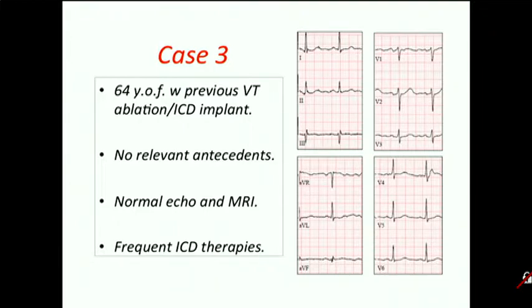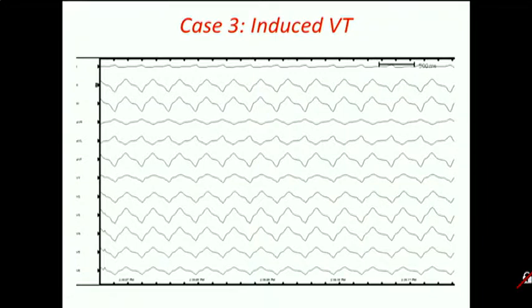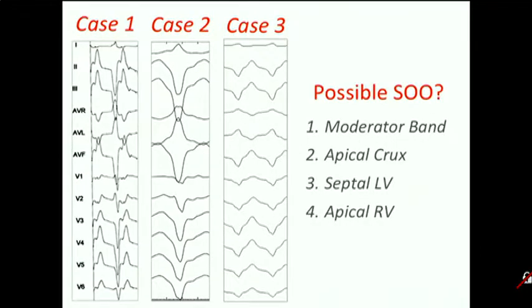The baseline ECG showed no relevant findings. And this is the ECG of the tachycardia in this patient. Here you can see once again the consistent pattern of left branch block with no transition. So there is negative concordance on the upper axis with QS in 2, 3 and aVF, and D1 is positive, suggesting probably that the upper axis is to the left.